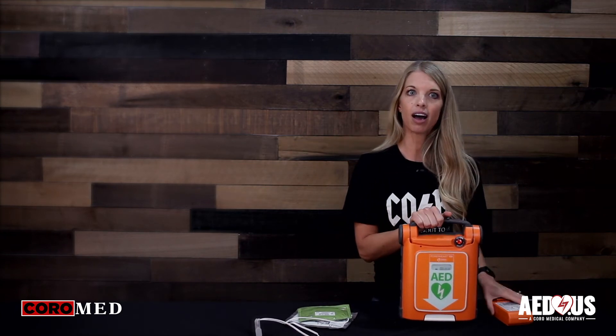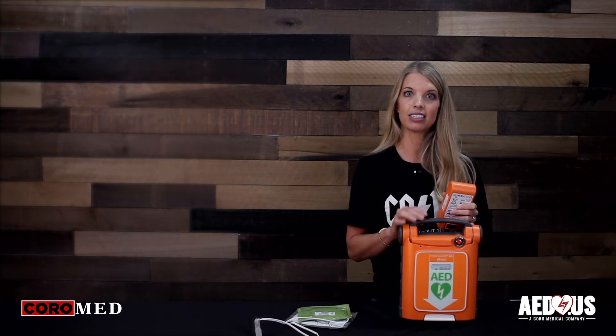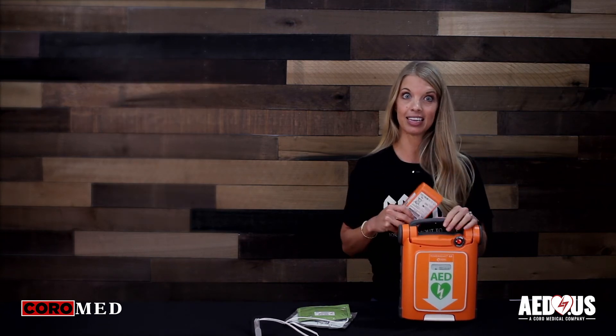The battery has a four-year guarantee. The lot number and the date of manufacture are listed on the outside of the battery. The guarantee begins once you place the new battery in the AED.